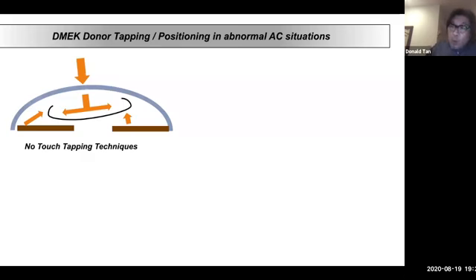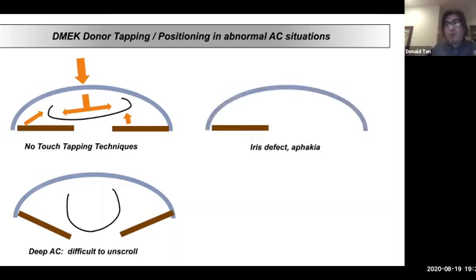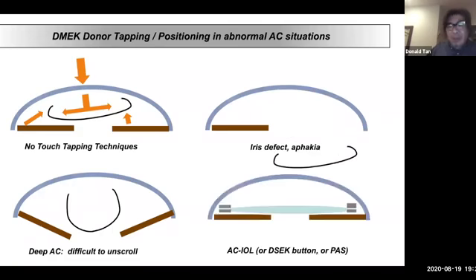And in abnormal cases where the anterior chamber is not normal, here, for example, is a deep chamber. We all know that it's very difficult to do DMEK, say in a vitrectomized eye, or God forbid, an aphakic eye, you know, and the iris is floppy. So you may never even be able to unscroll. There's nothing to tap against. There's no posterior surface. So very difficult. If you have missing areas of iris or iris defect, then again, very difficult challenge there. Aphakia, you don't want the tissue dropping in. So there are issues there. And if you have to tap against an ACIOL, then of course, I think there could be more damage as well, because you're tapping the endothelium onto the ACIOL.